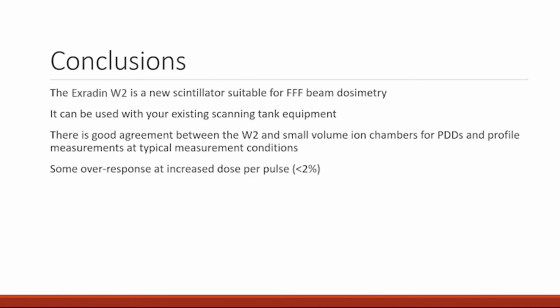Okay. Did you not have the sleeve adapter? We usually send a stem adapter with it that clamps onto the W2 and then matches basically standard scanning chamber stem sizes. Did we not include that in the loaner unit we sent to you? I don't recall. It's probably in there, but sorry about that.